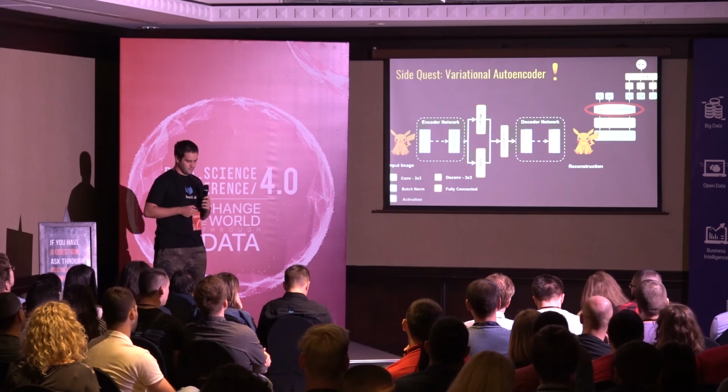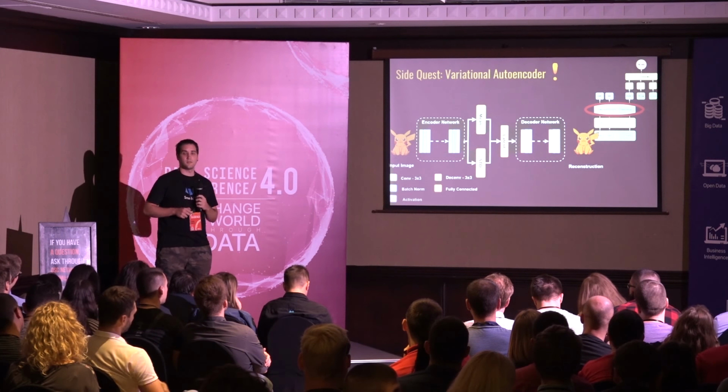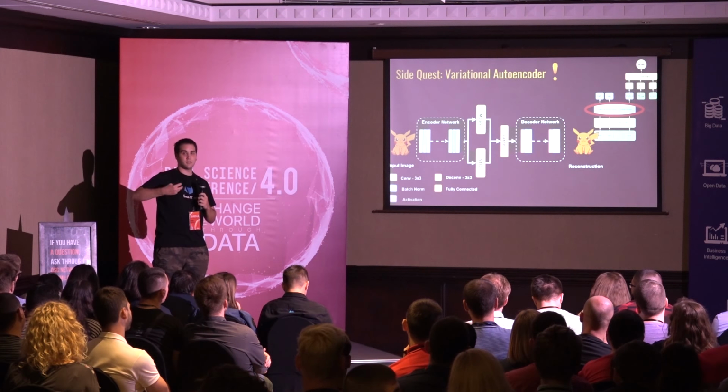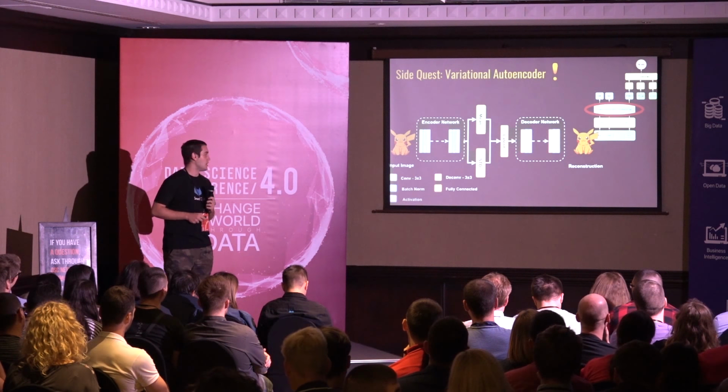And then the decoder network takes that feature vector and tries to reconstruct back this input image from only this feature vector.